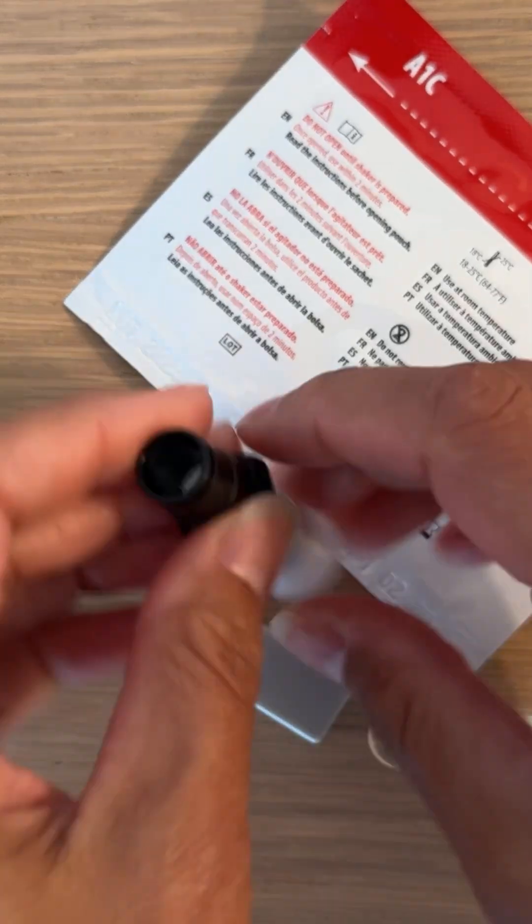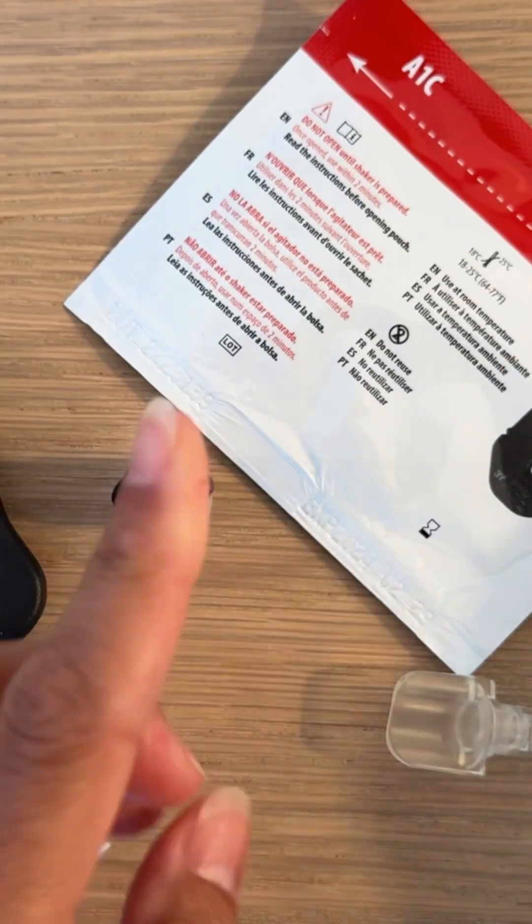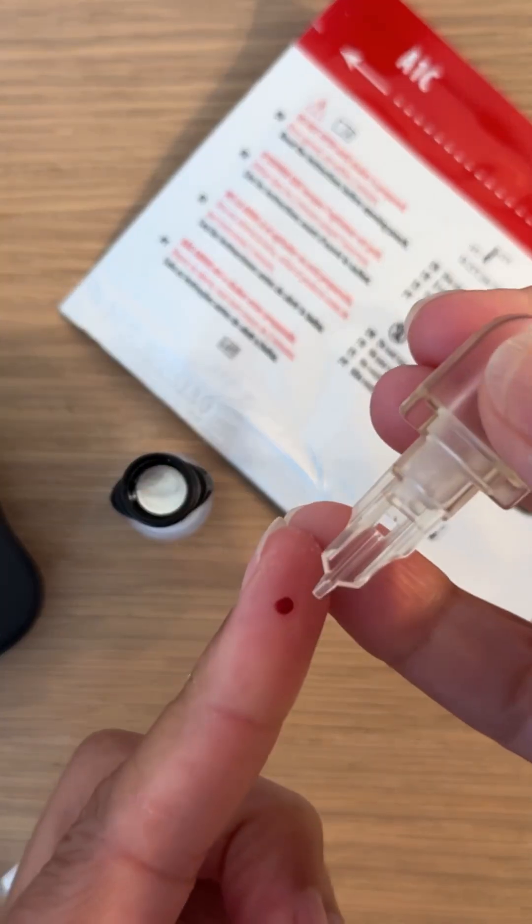Everything comes in the kit. This is a finger poker. I'm going to poke my finger — already washed my hands — and press out a good blood drop.